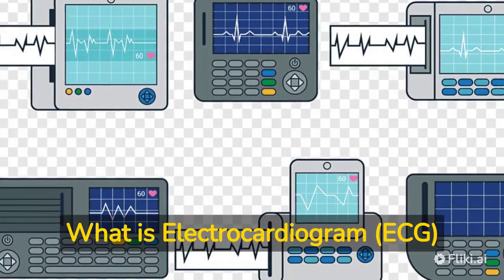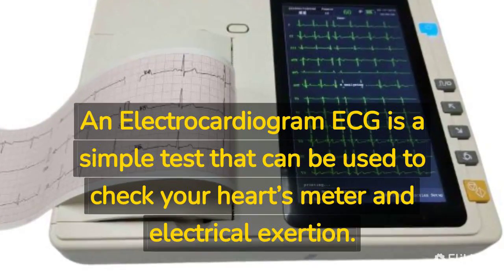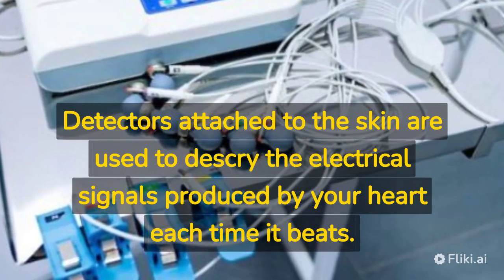What is an electrocardiogram (ECG)? An ECG is a simple test that can be used to check your heart's rhythm and electrical activity. Detectors attached to the skin are used to detect the electrical signals produced by your heart each time it beats.